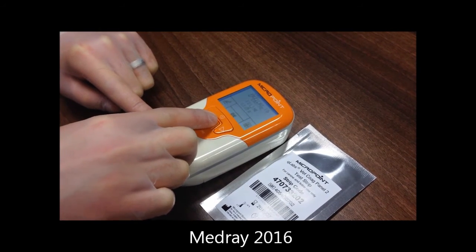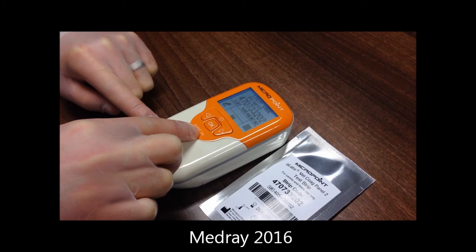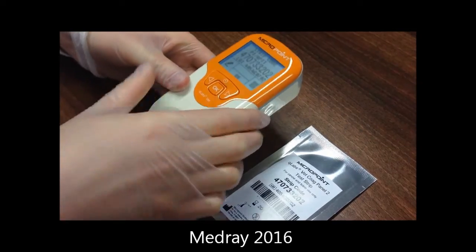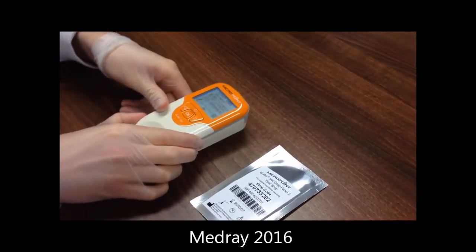Press OK twice to confirm and select the species, then press Enter again to confirm. The strip code will now be displayed. It is important to ensure accurate results that the code displayed matches the code on the pouch. If it doesn't match, simply activate the integrated barcode scanner and scan the barcode from the foil pouch, then press Enter to confirm.